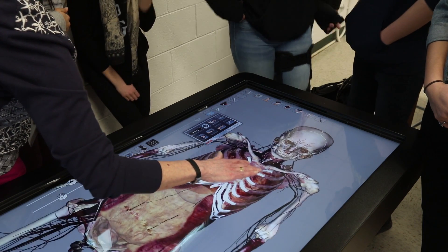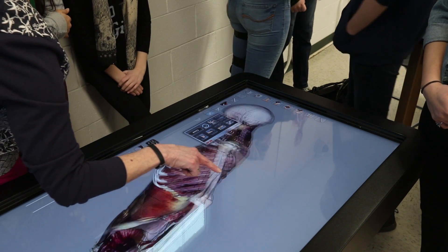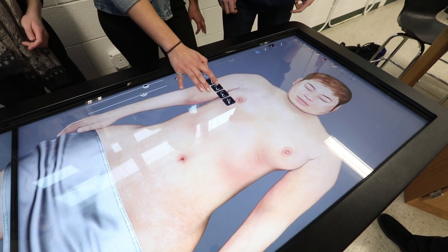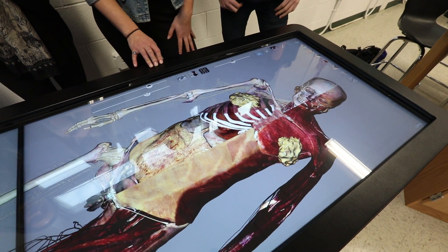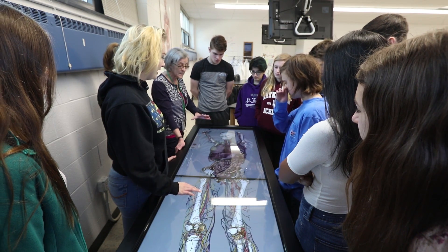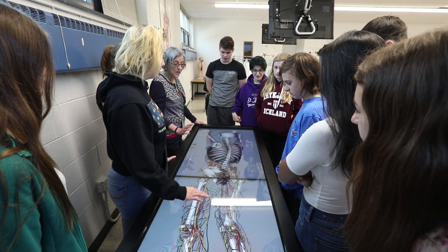Two fingers hold it around, one finger rotates it. We do anatomy very heavily in the second year, so the second year is really when the anatomy table comes into play. We can see all the different systems on the anatomy table — muscle systems that you couldn't see on a model, because you can only see superficial muscles on a model, but you can go all the way through all the muscles on the table.